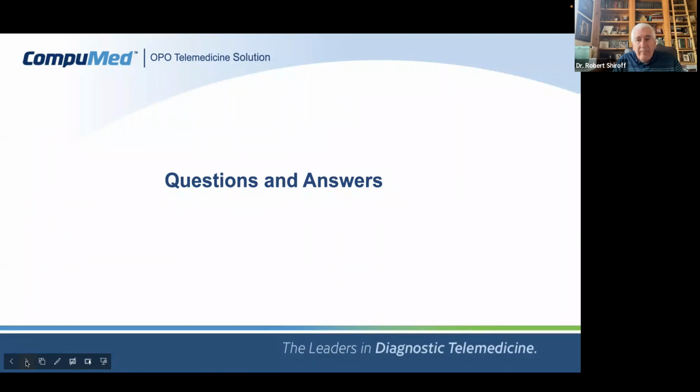Thank you, Dr. Shiroff. Stacy Hosenfield asked, what is the determination between a left-only cath and when a right-sided cath is indicated? Well, I think that it depends on the age of the patient and the situation. I think that in most circumstances, a right heart cath could be considered to be an indicated procedure. Many times we just see a coronary arteriography done as the only procedure, and I assume that's what she's talking about when she says left heart cath.